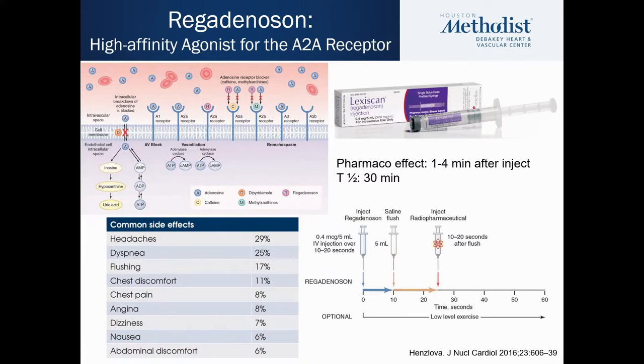This is a drug that in general has a very quick onset of action, and in fact, once you have injected the patient, you give a 5 milliliter saline bolus, and within 30 seconds, you're ready to inject your radiopharmaceutical. And the drug in general will last within your system for about 30 minutes.